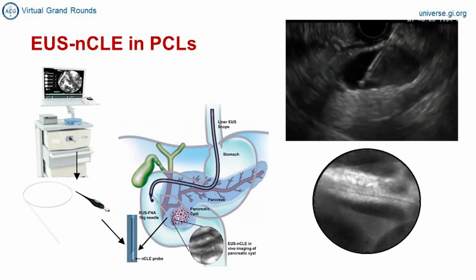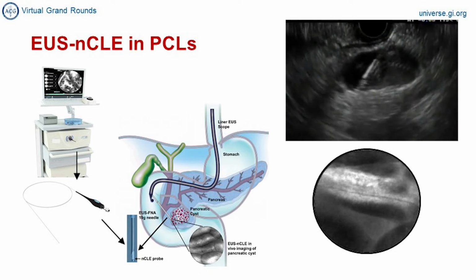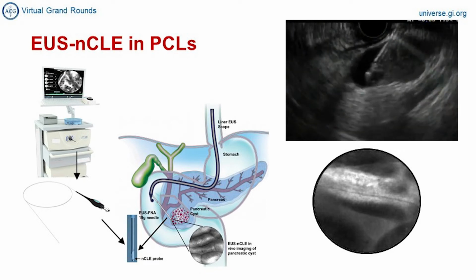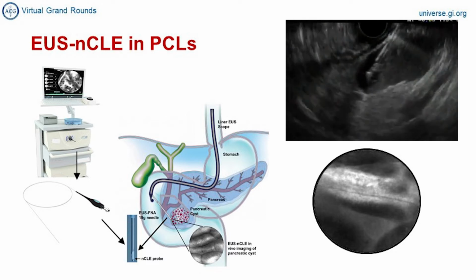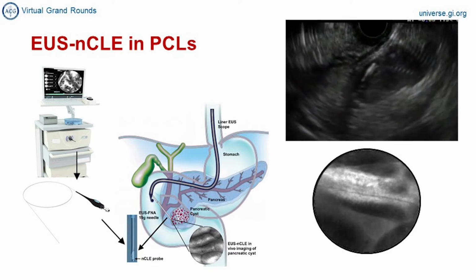You can later review the video and pause it at whichever points you want and make a diagnosis. You can make a diagnosis in real time, or you can get the optimal video and then review the case later on to come to a diagnosis.